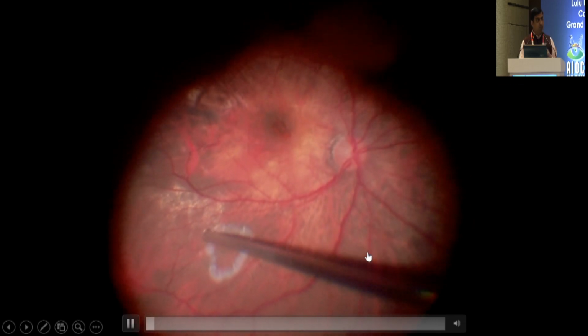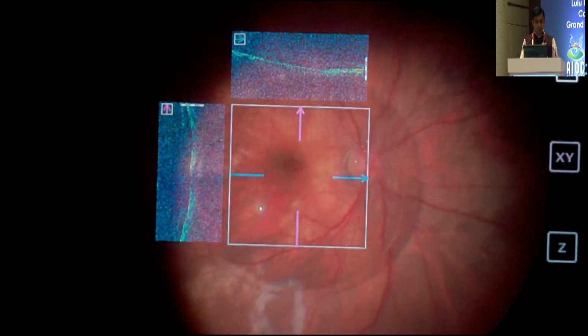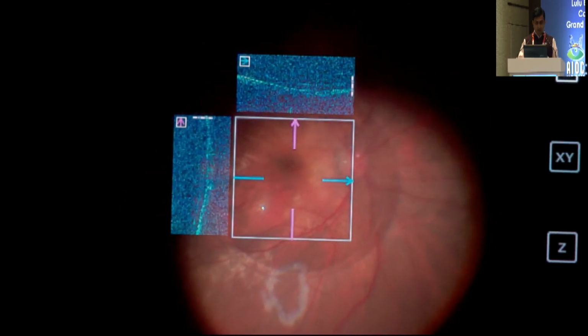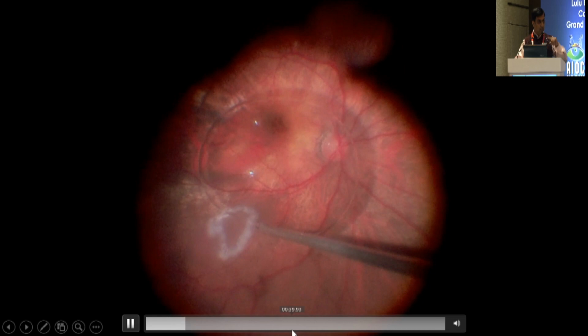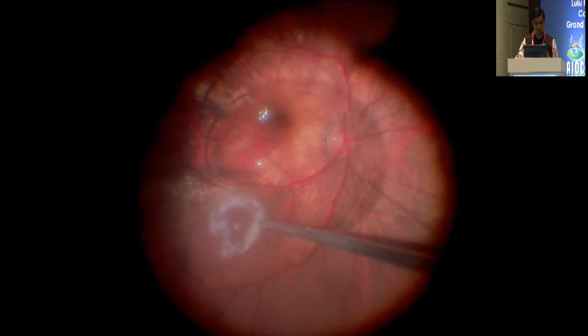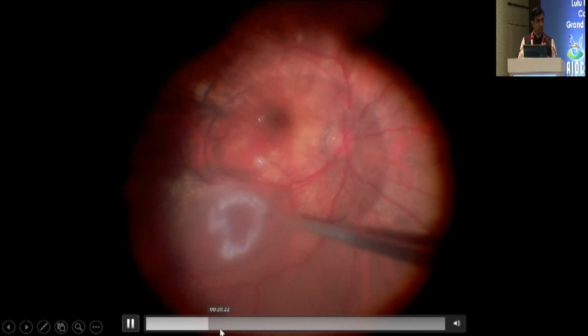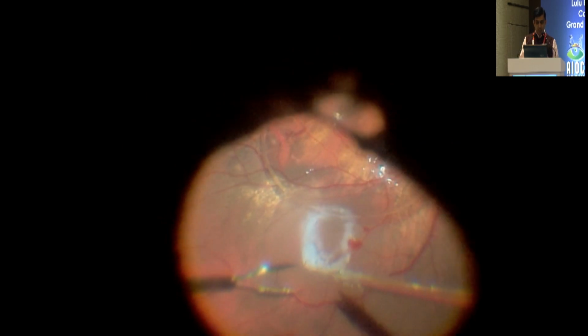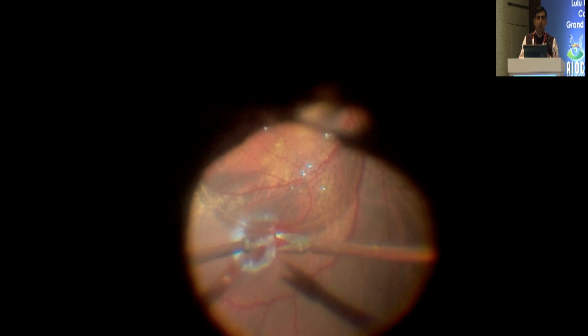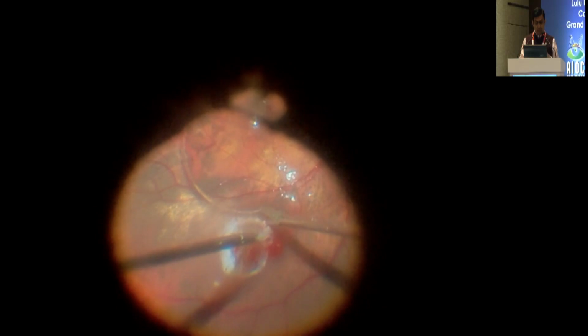Most of these procedures fail. The only procedure left is to do a neurosensory graft technique. So here you can see I'm doing a cautery around the retina because I don't want to have bleeding. I created a small blister using a 38 gauge needle and try to lift it, because while cutting that flap, we have to make sure that we don't cut the RPE or the choroid. Otherwise, it causes more bleeding. So I'm just trying to lift it and then cut it.